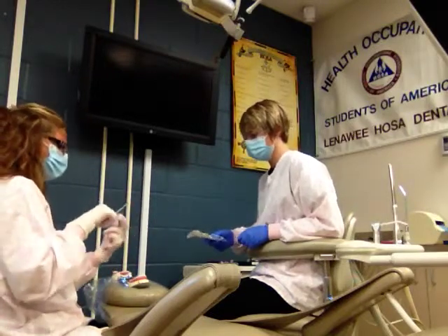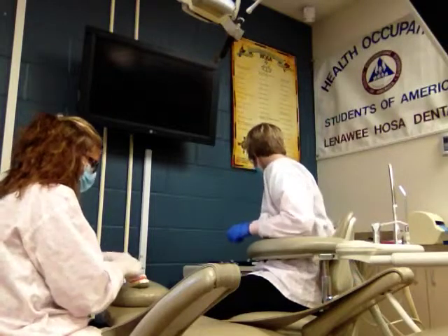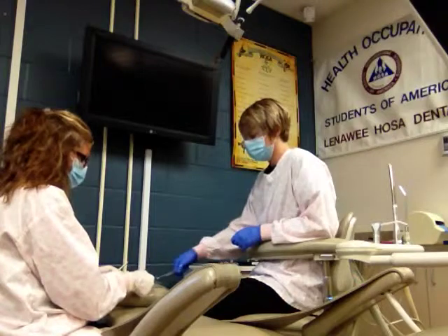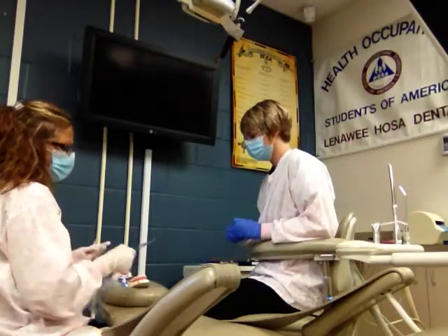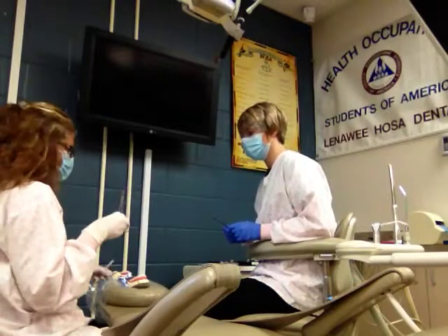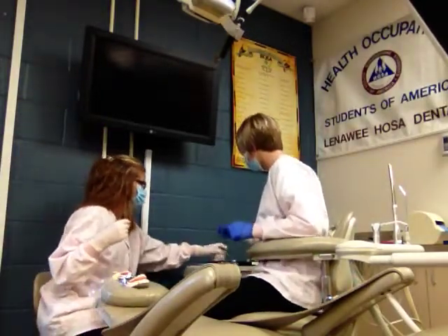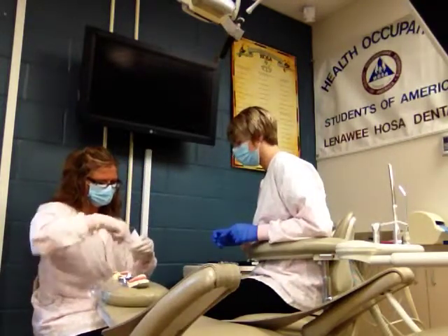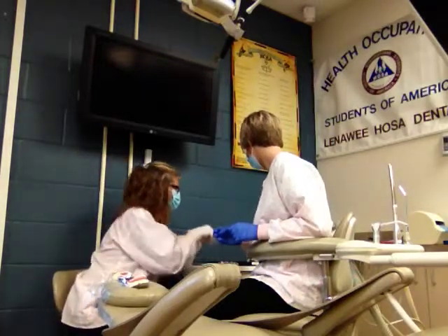So you pass the dentist the hemostats, and the dentist should grab out the suture. And what the dentist will do is actually stitch up that spot and tie a knot. As the assistant, what you're going to do is come in with the surgical scissors and actually cut right after the knot is placed. This is again very sharp. We don't want it just laying on the tray. So when we are done, it is best to put it back into the same container. And then of course that would go in the sharps container when we're all done.